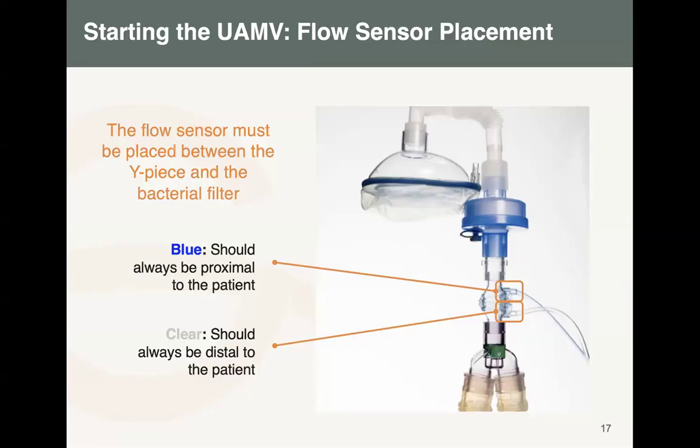I do understand there are some flow sensors which are not aligned the way this is. They are kind of interlinked from one side, but the alignment inside is as this one. So the connection should always be the same.